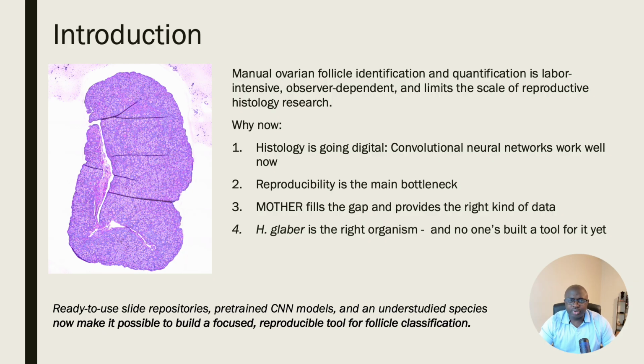We've reached the perfect storm of factors. For example, histology is now done digitally, and CNNs have become very sophisticated, very capable of analyzing large scale data. Plus, we have repositories such as the Mother database that provides ready to use high quality data to the public. And then we have the naked mole rat, which is an ideal biological species that no one has built an automated follicle identification system for.